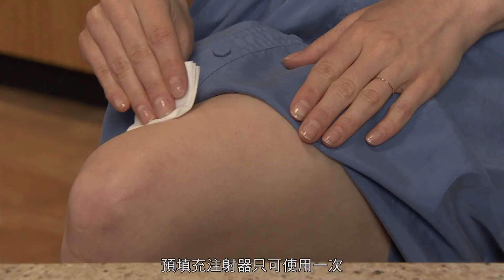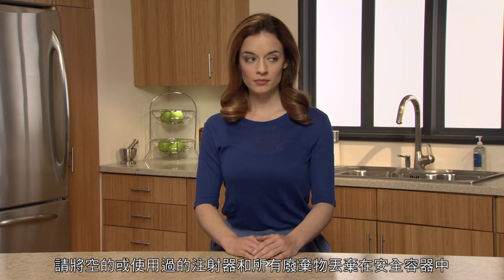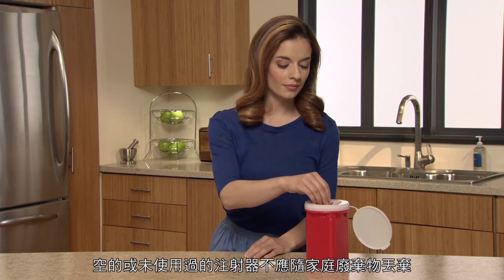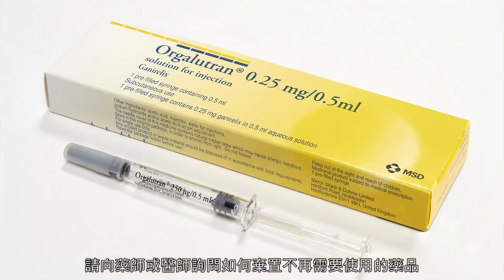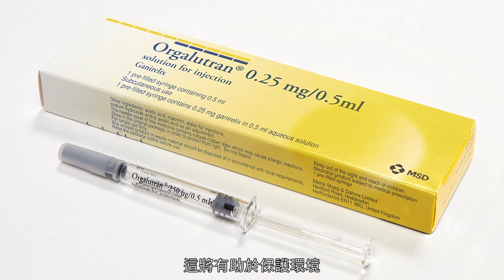Use the pre-filled syringe only once. When you are finished, dispose of your empty or used syringe and all waste in a safety container. An empty or unused syringe should not be disposed of via household waste. Please ask your pharmacist or physician how to dispose of medicines no longer required. These measures will help to protect the environment.